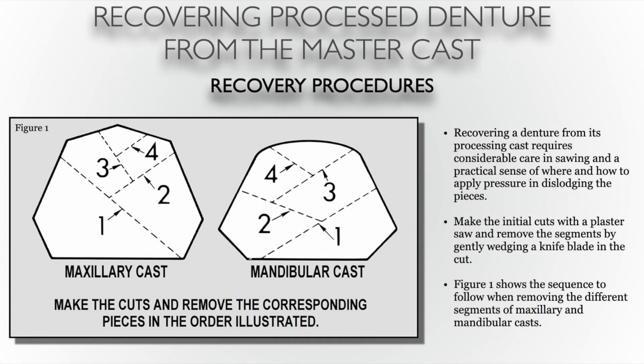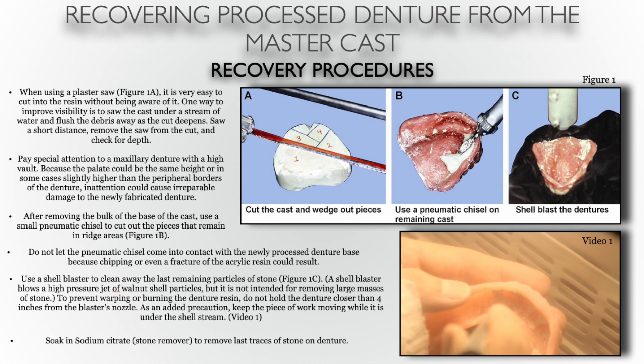At this point in time, you should have all of your complete dentures completely deflasked, still on the model, and selective grinding should have been performed. We now need to retrieve the dentures from the models without damaging the dentures. The illustrations here show the use of a plaster saw to section the model, the use of a pneumatic chisel to chip away any stone pieces that might be stuck in undercuts, and then making use of a shell blaster.